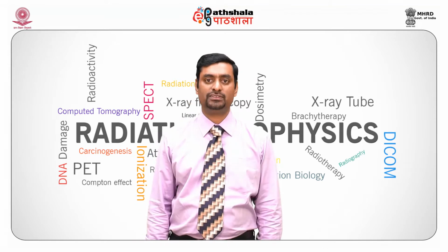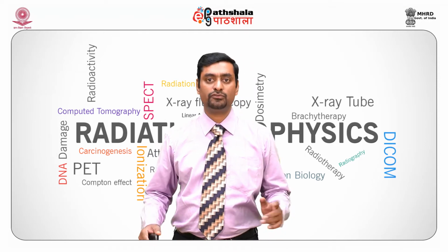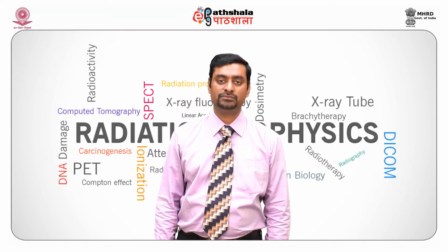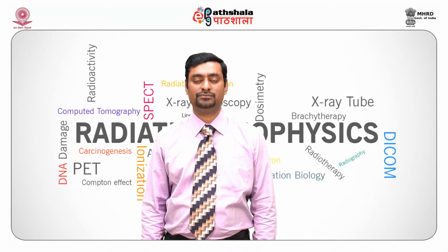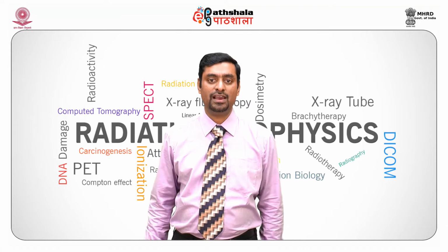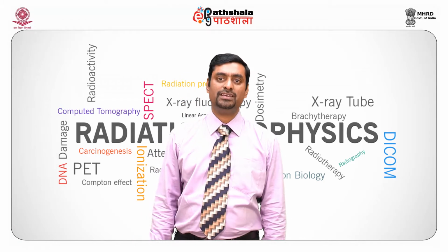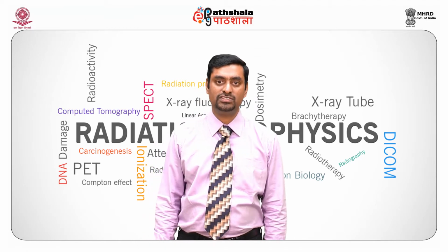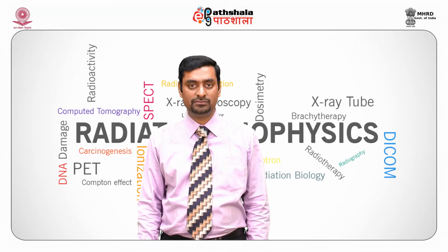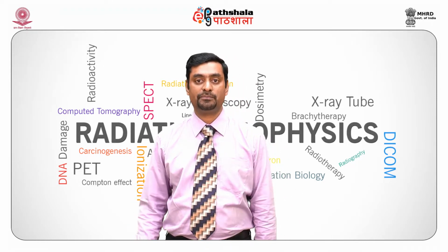What is fluoroscopy? Where is the origin of fluoroscopy? The origin of fluoroscopy can be traced back to 8th November 1895 when Wilhelm Conrad Röntgen noticed a barium platinocyanide screen fluorescing as a result of being exposed to X-rays. Fluoroscopy is a radiological examination which uses X-rays and a fluorescent screen or a detector to visualize the internal structures of the body in real time.